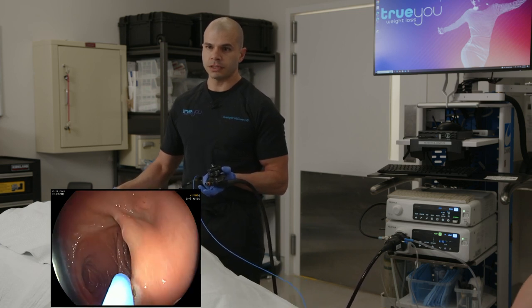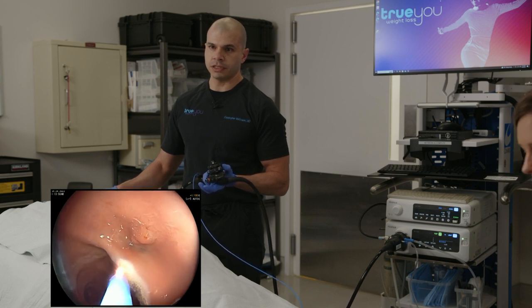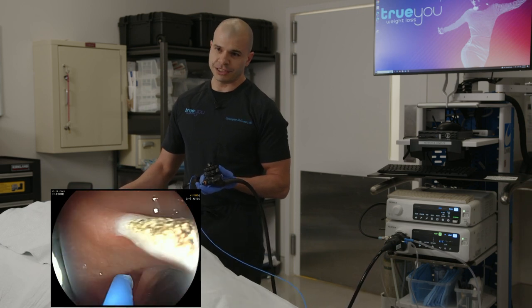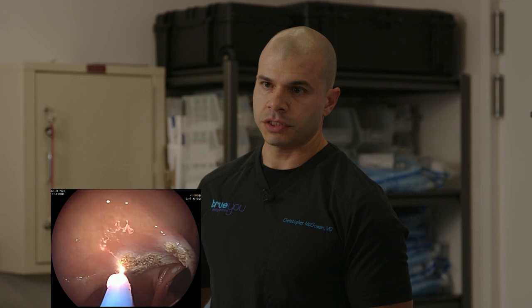And so what you'll see is the outlet will start to tighten as we make our way around. And there you can see that flame. What I'm aiming for is the gastric side of the anastomosis. We don't want to burn the jejunum or the small intestine. So I'm going to treat this circumferentially. And just making my way around.